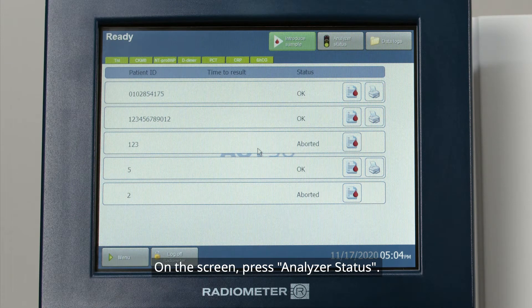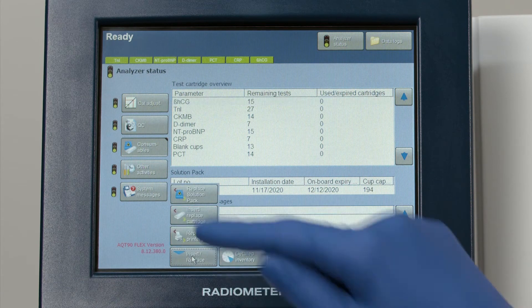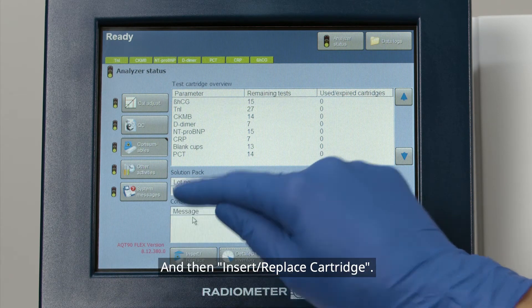On the screen, press Analyzer Status, then Consumables, then Insert Replace, and then Insert Replace Cartridge.